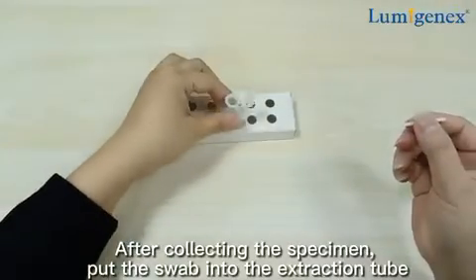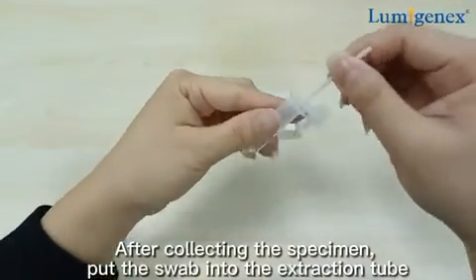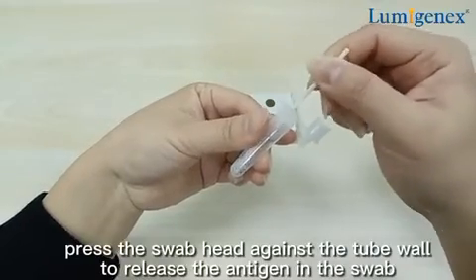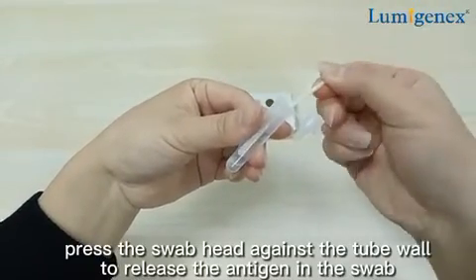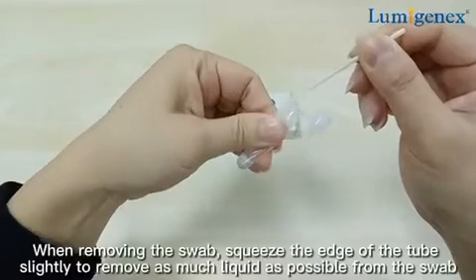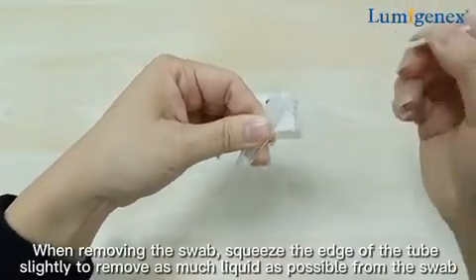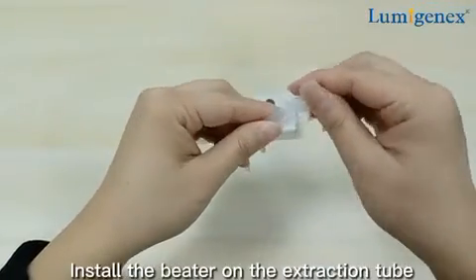After collecting the specimen, put the swab into the extraction tube. Rotate the swab for about 10 seconds and press the swab head against the tube wall to release the antigen in the swab. When removing the swab, squeeze the edge of the tube slightly to remove as much liquid as possible from the swab. Install the plug on the extraction tube.